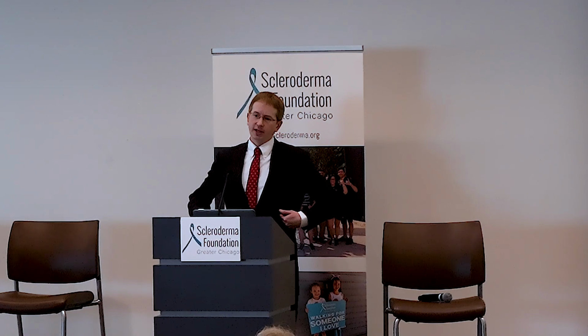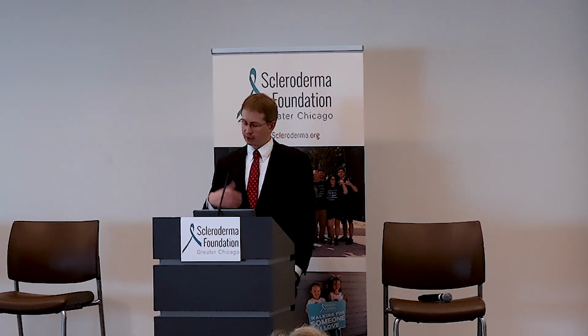Can ultrasound help us do that in a way that's clinically meaningful? There's actually been a fair amount of research in using ultrasound to detect scleroderma-related lung disease because you have ribs in the way, but in between the ribs, you can look into the lungs with an ultrasound. And then, Dr. Richardson was talking about calcinosis, and ultrasound has some role in that, in detection and targeting it.